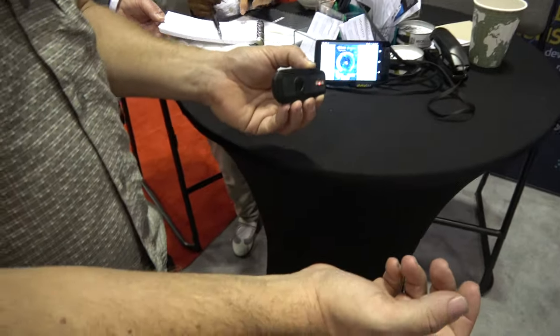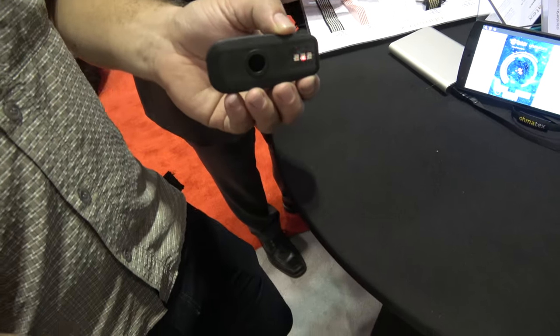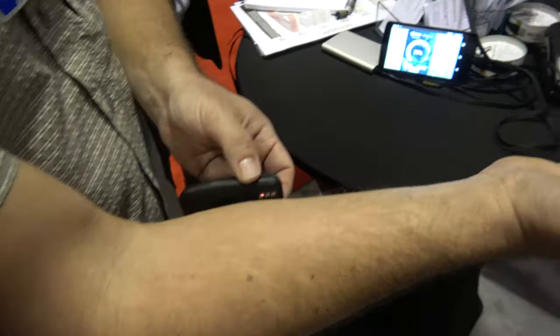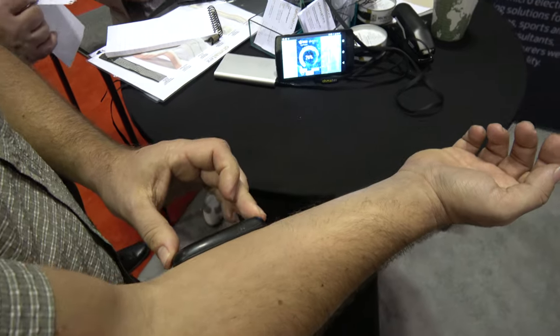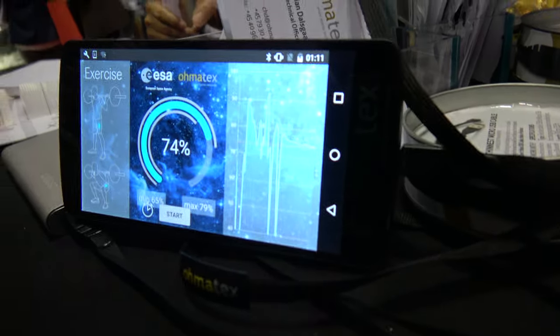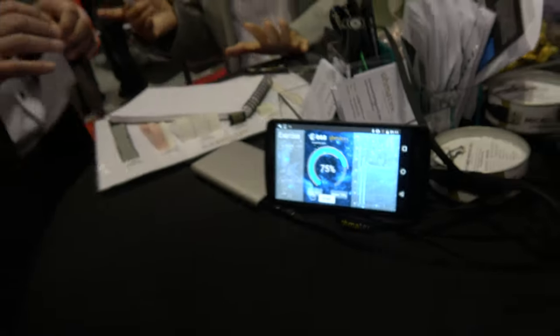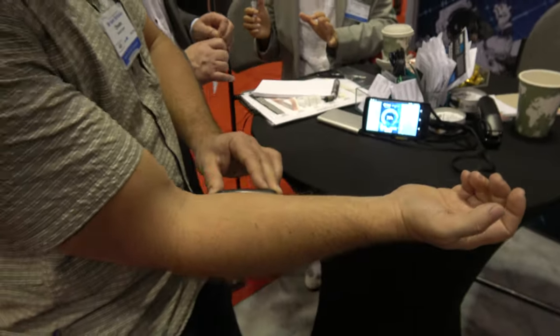I'm looking at the near infrared oxygen measurement of the muscle. We can measure about one inch into the muscle tissue and measure the oxygen levels. When you hold it on the muscle, it stabilizes.